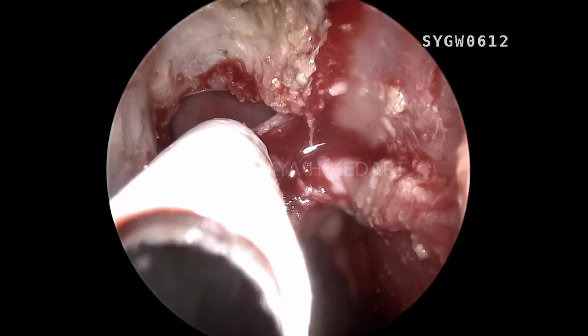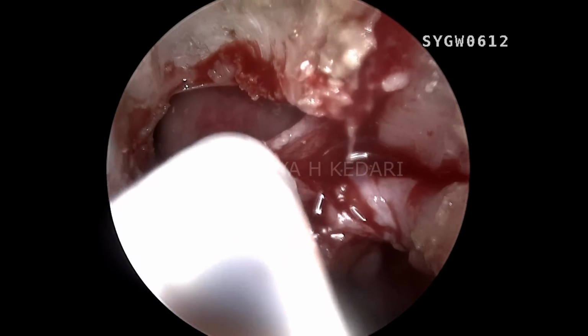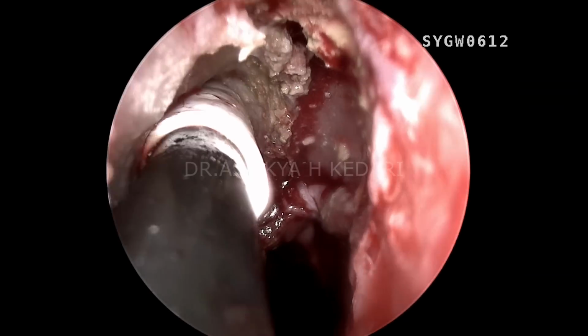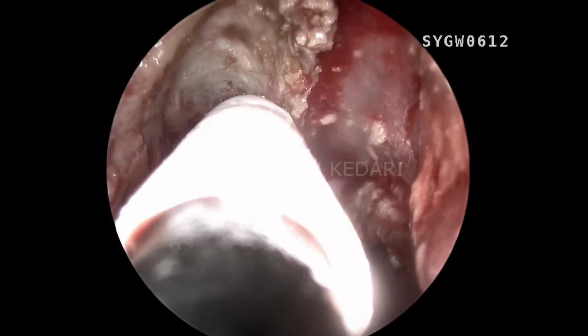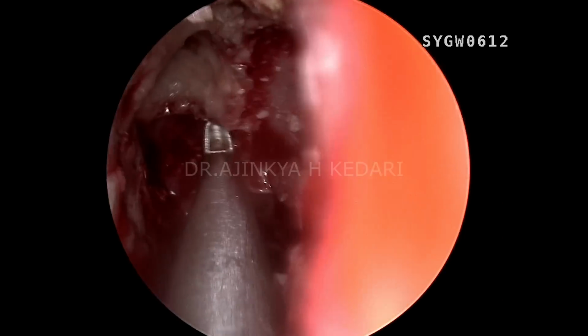You can see the huge bulge, that's the suction, that's the bulge of the frontal lobe of the patient's brain. So you can see that's very close to the anterior wall of the frontal sinus, and that's all the skin out there at your 9-11 o'clock position. So I need just to drill that.